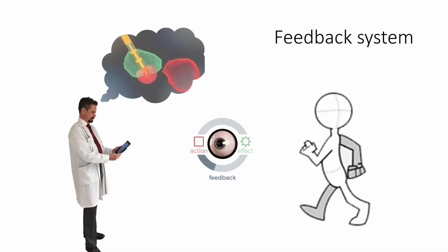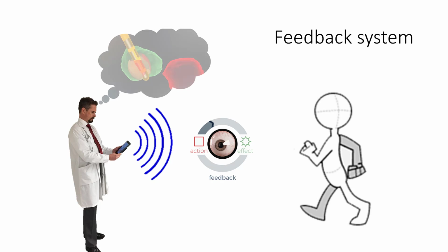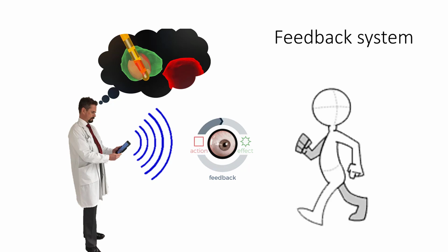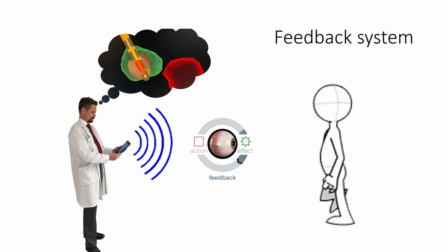This is a feedback system where we will look at a map and then try some stimulation settings and the field of stimulation based on the map. We will then look at the stimulation response regarding effects and side effects, and in light of these, reinterpret the map and refine the stimulation parameters before we will make the final adjustments, mainly based on the stimulation response.